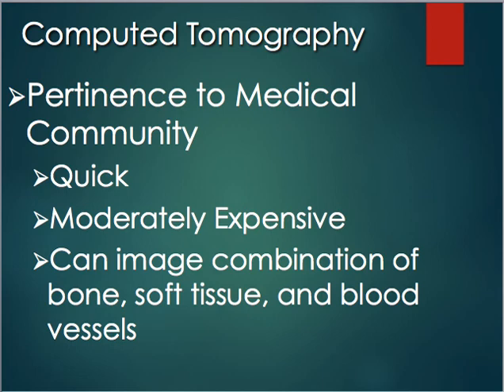CT is actually one of the best imaging tools for studying the lungs and the abdomen. And CT is invaluable in the diagnosis of cancer, strokes, and heart disease. There was actually a study done in ER departments that showed after a CT scan of the chest was done, the treating doctor, their diagnosis changed 42% of the time.